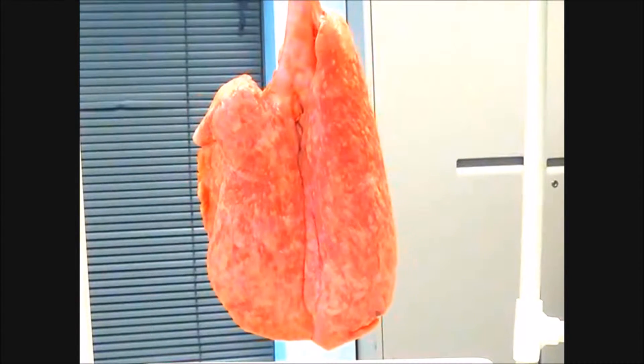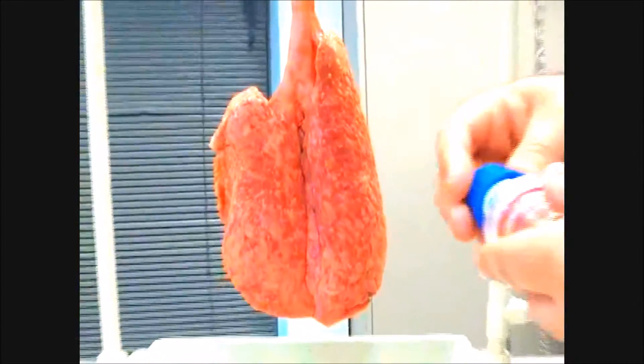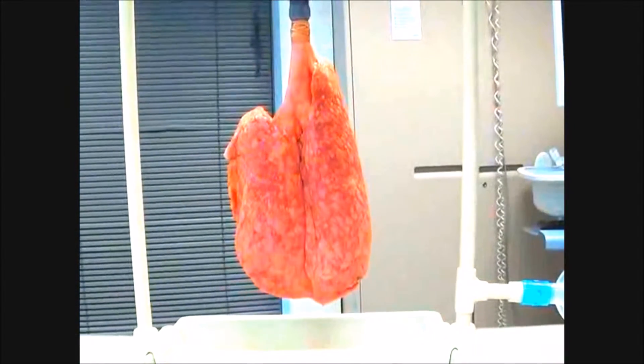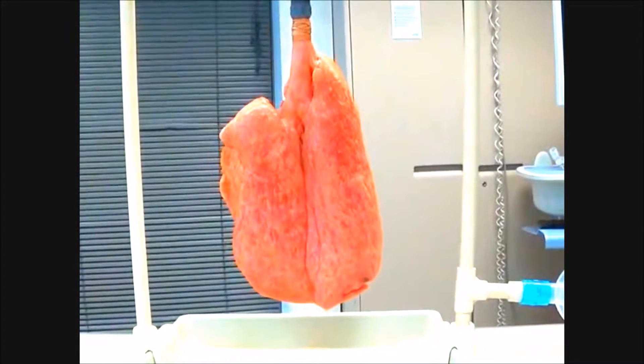So the next time you're bagging a patient, think about this. Now I'm going to put the PEEP valve on and start with 10 of PEEP. I've set this at 10 of PEEP, placed it on, and now I'm going to start bagging with 10 of PEEP.